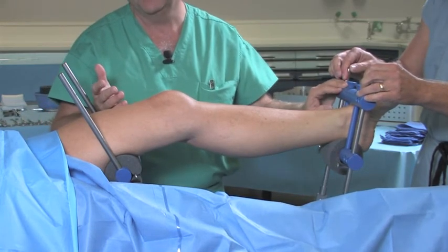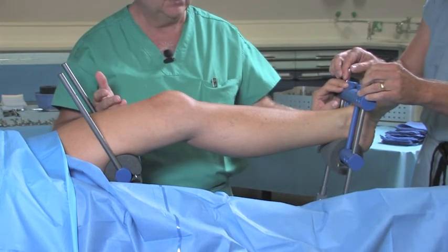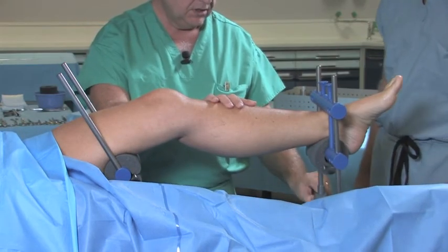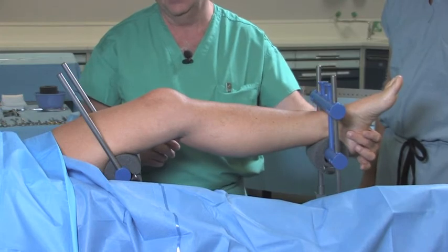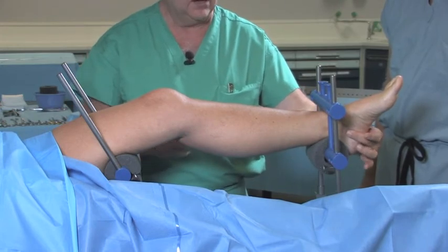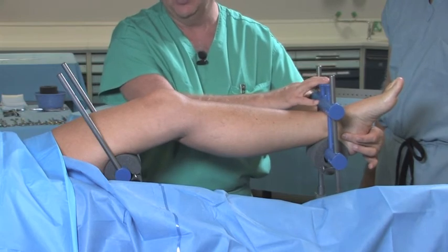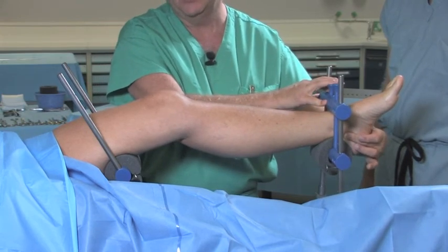This will give you a gentle skin traction of anywhere from 10 to 25 pounds. Alternatively, a calcaneal pin may be placed, which will then serve as a traction point that we can pull on for traction.